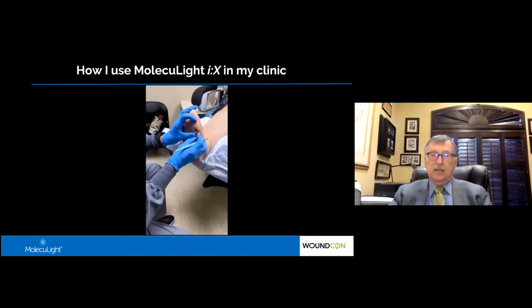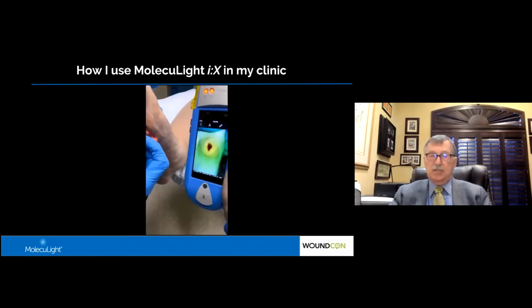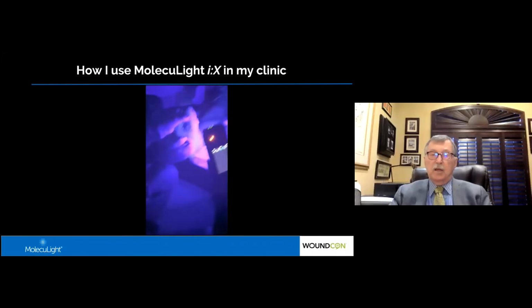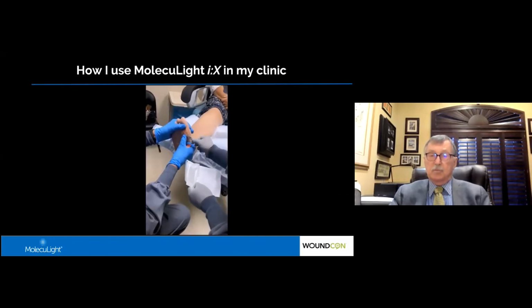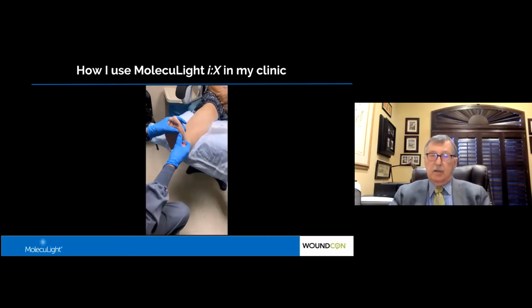It's amazing how much you see with the device that you do not see with just looking at it with the eye. Once we do the debridement, then we'll re-image that wound to make sure that we've been able to remove as much as possible of that bioburden.